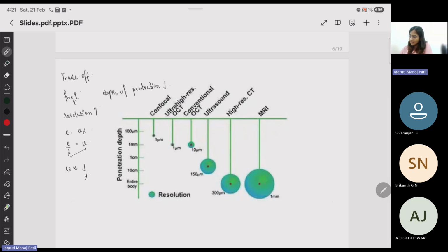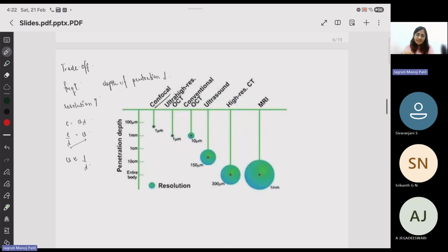And this is a type called confocal. It is a type of imaging which helps you image at multiple planes all together at one time. So I'll give you an example here. People work with microbubbles. You can consider them equivalent to air bubbles, but the size is in microns. These microbubbles have a lipid based shell, and inside it has air.